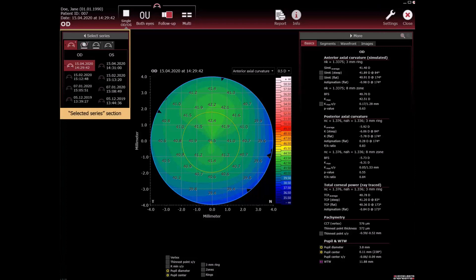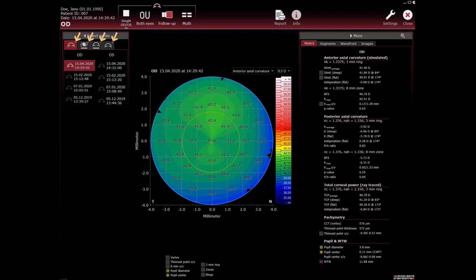Selected series section. Series per application are divided into OD and OS and are sorted by examination date and time with the most current examination on the top of the list and automatically displayed. Number next to the symbols means how many acquisitions per application and patient.